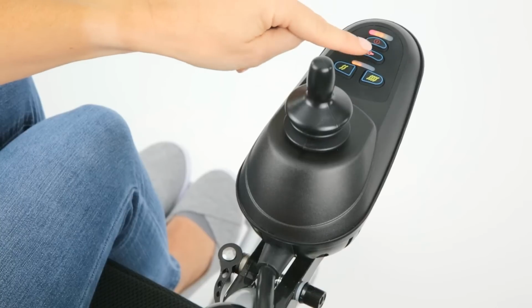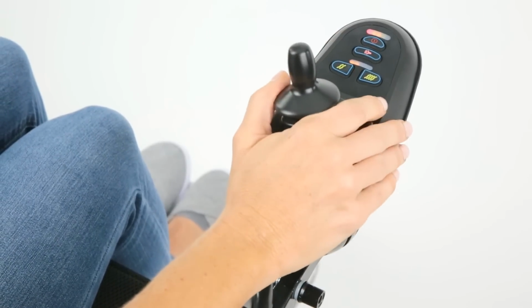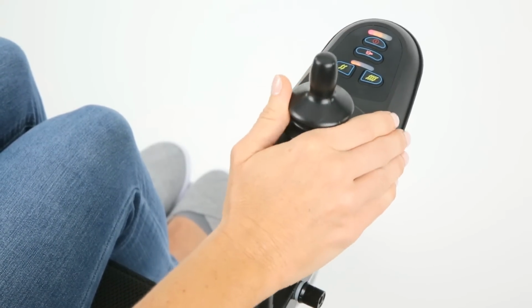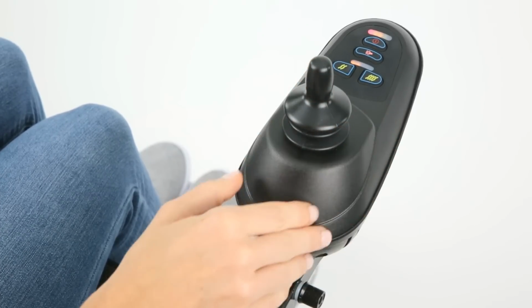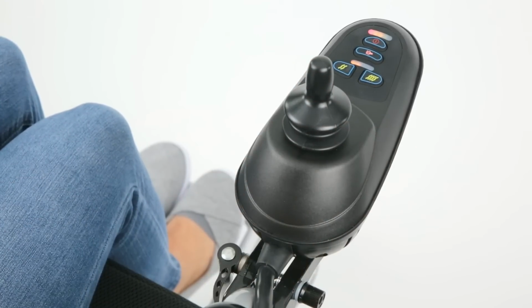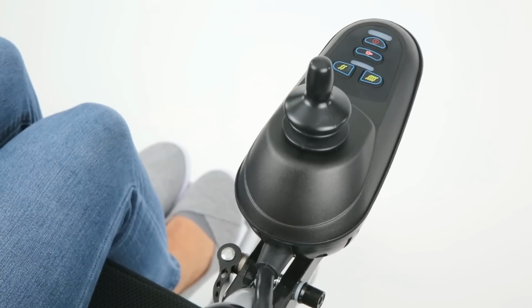To beep the horn, push the horn button. Use the joystick to control movement, speed, and direction. When you're done using your power wheelchair, simply press the power button to turn the device off.